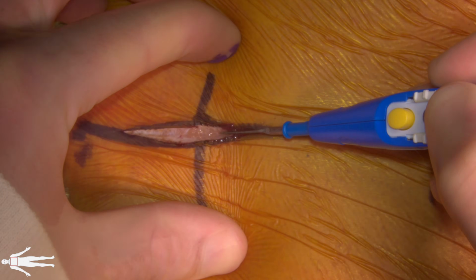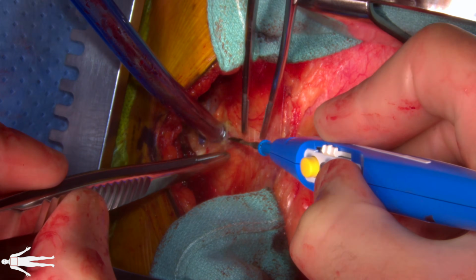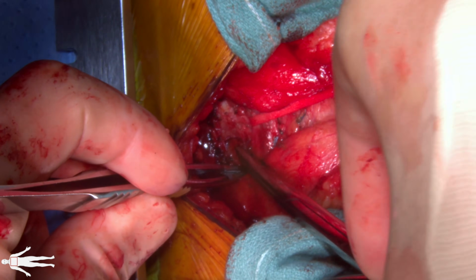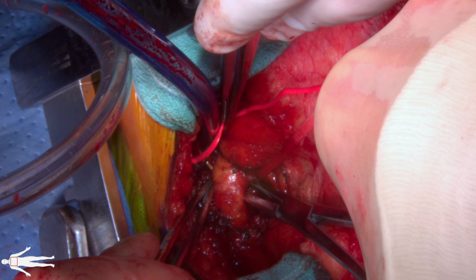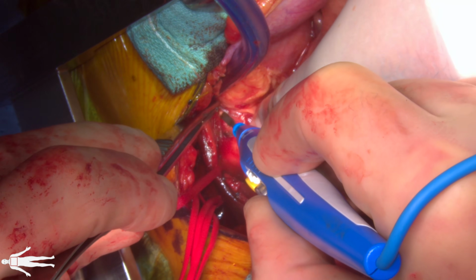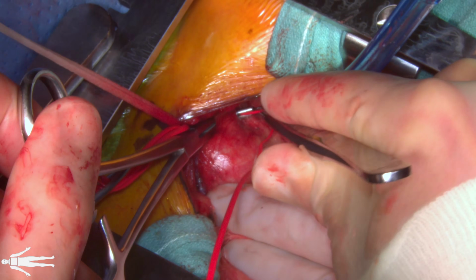Midline sternotomy was carried out in standard fashion. The innominate vein was then dissected out and encircled with an umbilical tape. The innominate artery was then freed and encircled with a vessel loop. The left common carotid artery was also controlled, followed by creating a pericardial well.